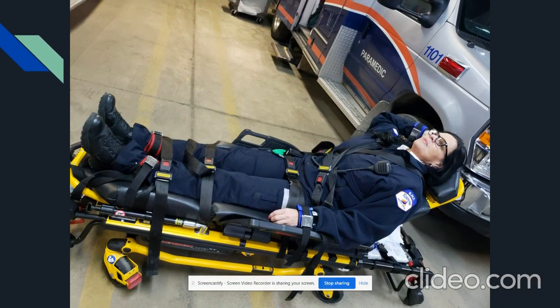And here is just a full side view of the 4 different restraints on the 4 limbs. Again, she is still buckled with the 5 seatbelts, and then she does have the 4 limb restraints on as well. They're all very secured. They are secured to the metal frame of the cot, and then to her ankles and wrists, as well as locked in to the brace or the metal part of that cot.